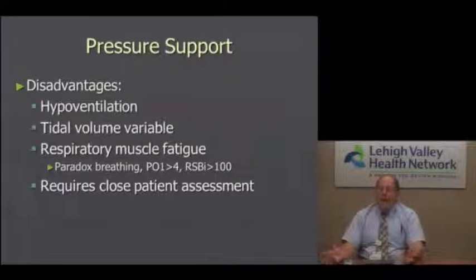Now, it's not a panacea, it comes with its problems, and again, if patients stop breathing, they become hypoventilated. Tidal volume varies, it's a pressure mode of ventilation. So if a patient becomes tachypneic, their I time shortens, their compliance or resistance changes. For example, I have a patient on pressure support of 10 doing very well, exhaled tidal volumes are 400, respiratory rate's 15. All of a sudden they go into CHF, now their respiratory rate's 30, and their tidal volume might be down to 200 because their compliance and resistance have changed.